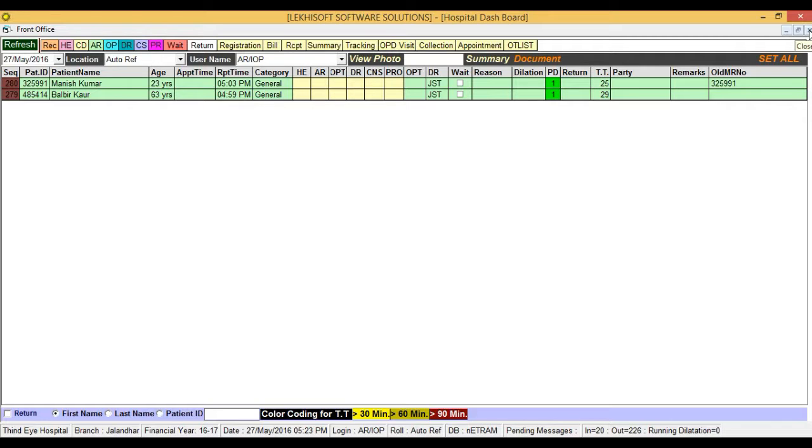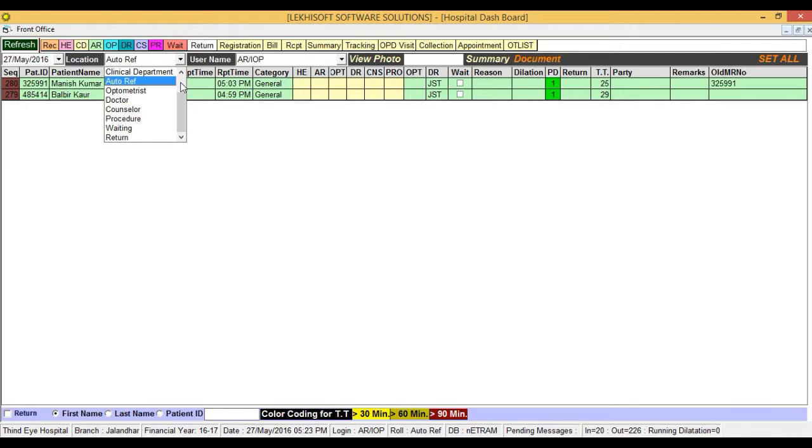In case you want to see all patients, just click on the drop-down menu.